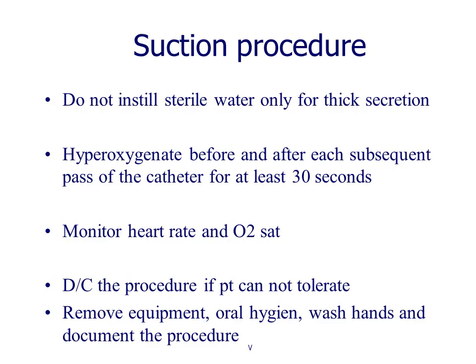Remove equipment, oral hygiene, wash hands, and then document the procedure. Document everything: the time of the procedure, any complications encountered, any respiratory distress that may occur during the procedure, that the procedure was performed successfully and the secretion was removed. The description of the secretions should also be provided.